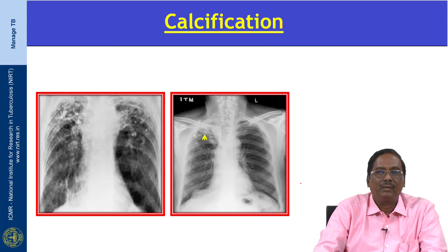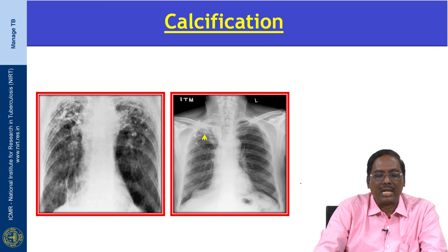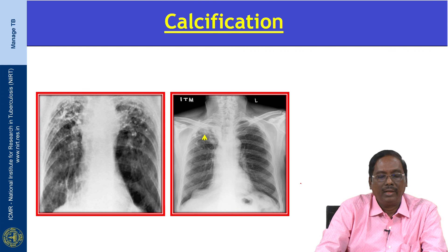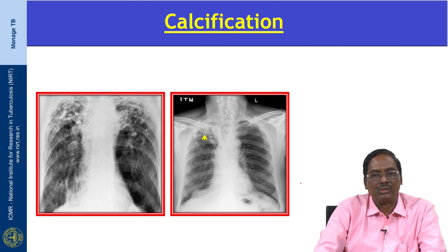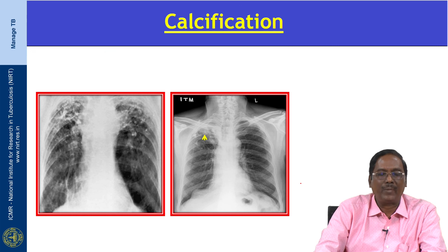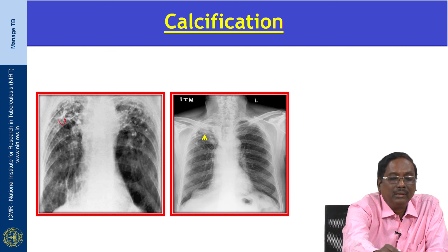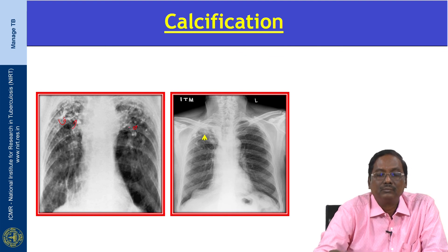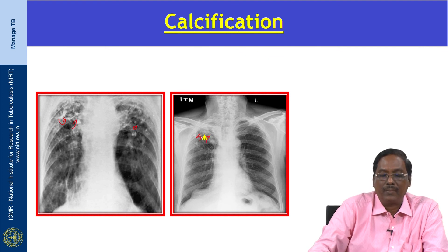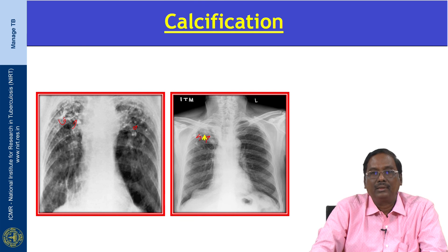These are various parenchymal calcifications — dystrophic calcification occurring in the damaged lung following TB infection. It is a local organized process with local deposition of crystalline hydroxyapatite calcium salt. Here we can see multiple parenchymal calcifications.